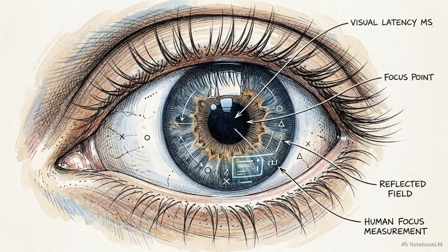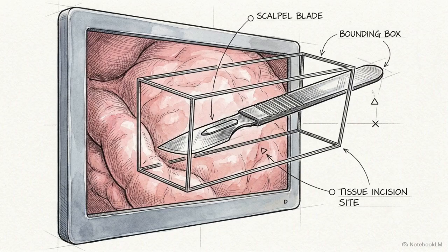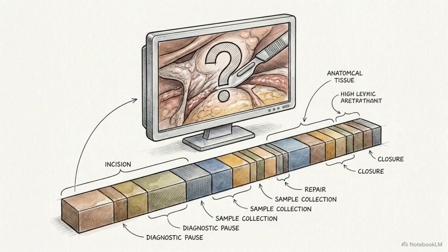Intraoperative tools require a strict latency budget of 50 to 100 milliseconds. If the model is too heavy, it cannot process the video stream fast enough to be useful. Identifying a scalpel or a gallbladder in an isolated frame is a spatial achievement, but it does not tell the system what phase of the surgery is actually occurring. To establish context, the system acquires surgical process understanding.